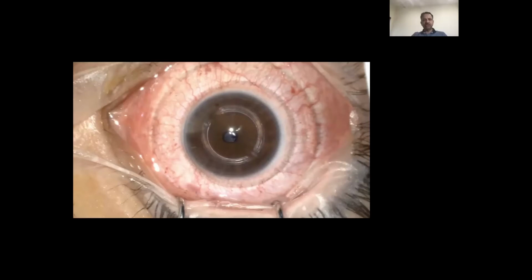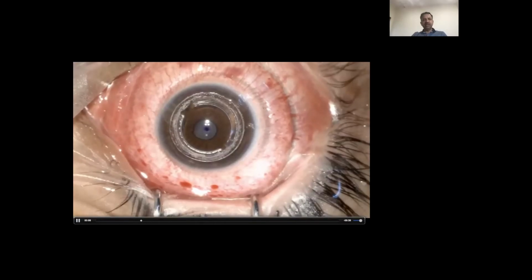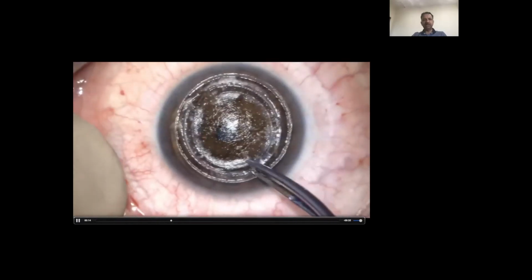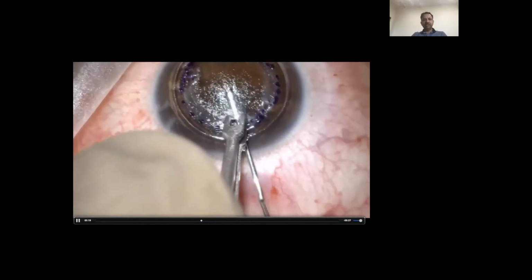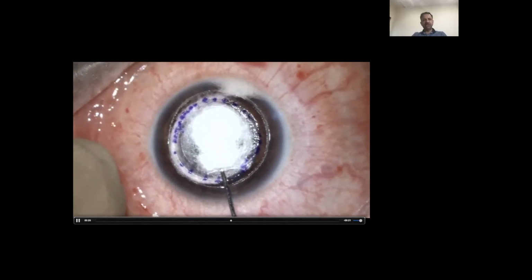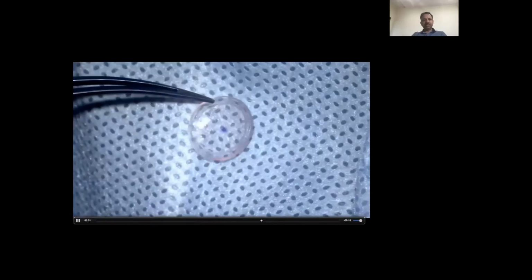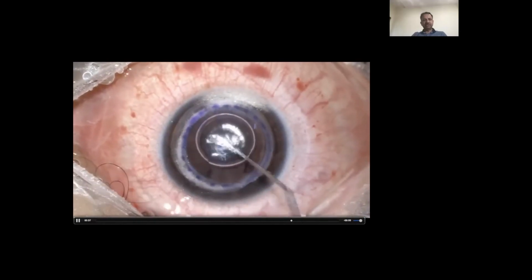Now, just to show you, this is a patient who had intracorneal rings and was not satisfied with the outcome. So we used the femtosecond laser. I'm working with a Ziemer Z6, and created a mushroom-shaped corneal incision where the anterior corneal diameter is larger than the posterior. We removed the intracorneal rings, and then using the same track, we introduced our blunt cannula, and you can see that we are enlarging the big bubble, deflating it, and then you can excise the residual stroma, and prepare your donor tissue. It's the same size, diameter, same parameters, and you can place sutures to secure it in position.